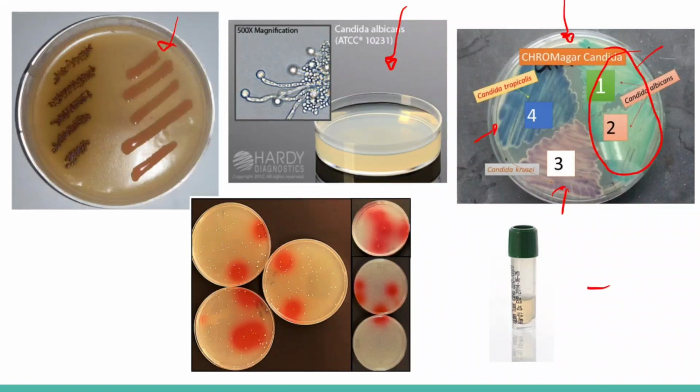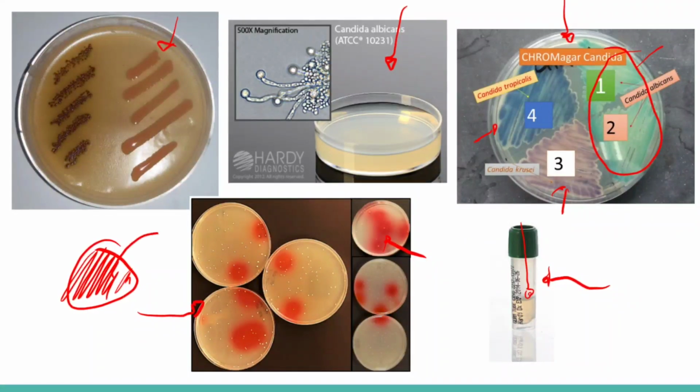And next, we have the germ tube broth. Ayan, so bovine serum, lalagay mo lang yung yeast colony, and then check mo na lang under the microscope after 3 to 4 hours. Next, we have the nitrate reduction agar. So, kung negative yan, dapat red lang yan. Originally, it is a red agar. Pag na-reduce siya, magiging siyang ganito. So, pag na-reduce, malamang hindi yan Cryptococcus. Pag negative or pag pula pa rin siya, so that is your Cryptococcus neoformans confirmation.